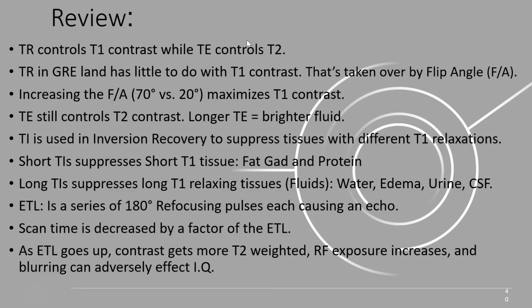So just in the back of your mind, know that all images with bright fluid are not necessarily T2. They would have to tell you this is a STIR image or an inversion recovery image. Fluids are going to be bright on a short time inversion recovery, so you need to know your factors there. But in general, look for fluid, and if you see bright fluid, it's T2.